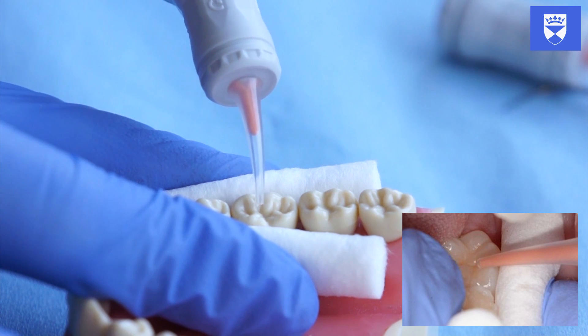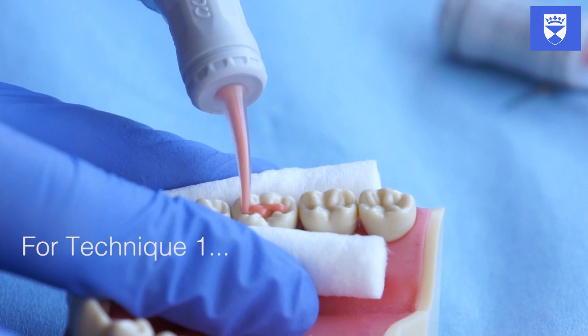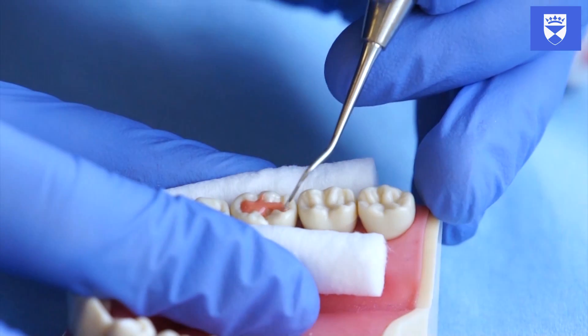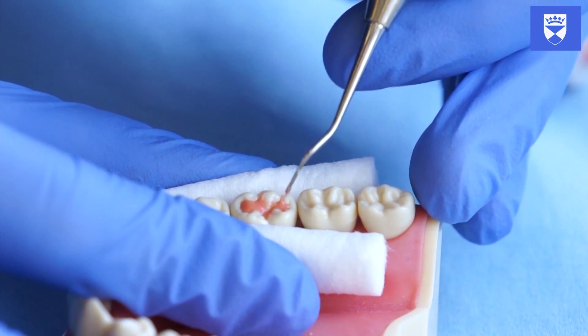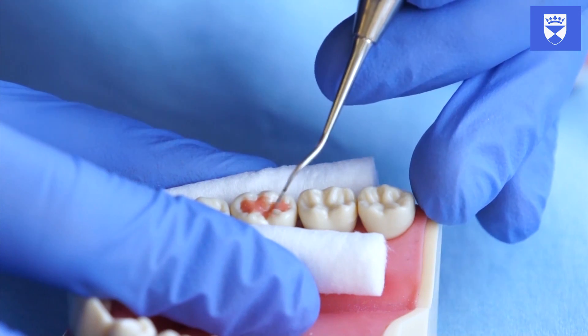The glass ionomer can be introduced onto the fissure pattern using a blunt ended instrument such as a flat plastic, or directly if using capsular glass ionomer. Gently apply the glass ionomer to the fissure pattern. Ensure that there is enough to cover the entire fissure pattern but not extend up the sides of the cusps more than approximately one millimeter. Shape and contour the glass ionomer with a flat plastic instrument.